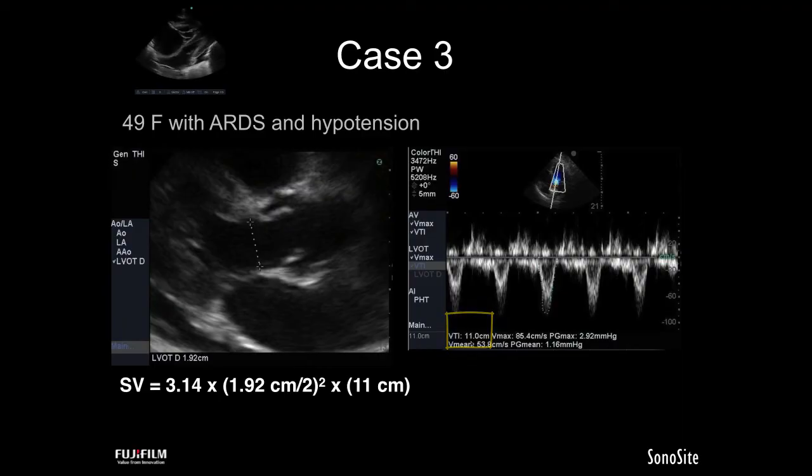Not very significant. Again, we saw the LV contracted well, and we see it in the upper left here. Great LV systolic function, but lousy output. Why? Well, of course, that's consistent with right-sided obstructive physiology. No blood is getting to the LV, so even though it might meet hyperdynamic criteria, or at least normal criteria, it has a lousy stroke volume because it has a relative preload problem. However, this isn't a total body preload problem, it's just an LV preload problem.